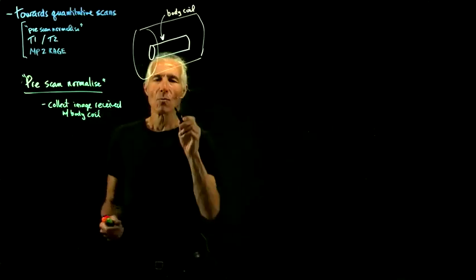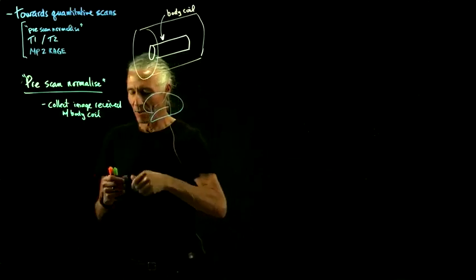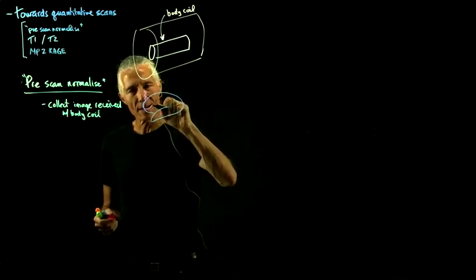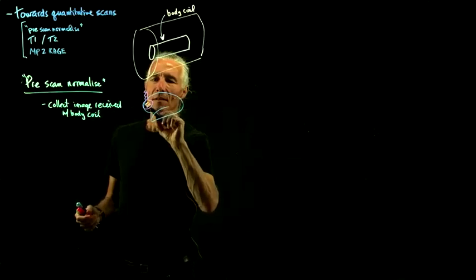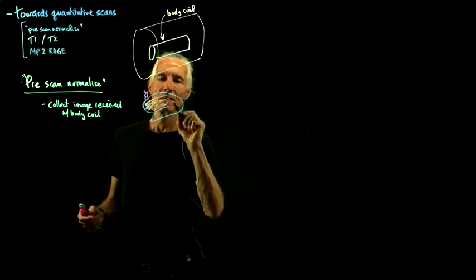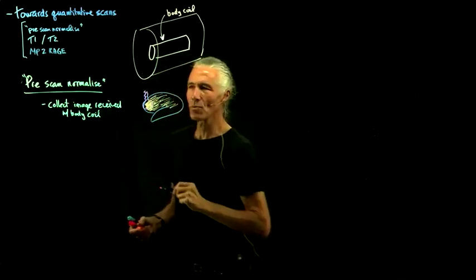And why doesn't it have to be a high resolution image? Because if you look at the brightness differences that come from being really close to this coil over here, the image is going to be brighter right around that coil, and it might be 200% brighter than the rest of the brain, but it's going to fall off nice and slow. So when you look at this brightness field, it's nice and smooth.